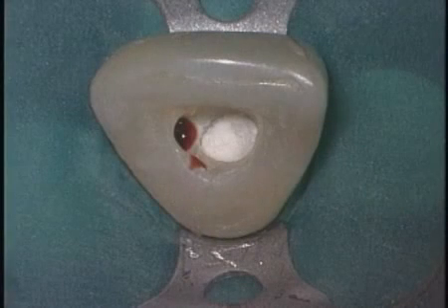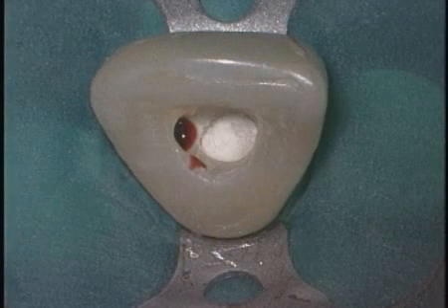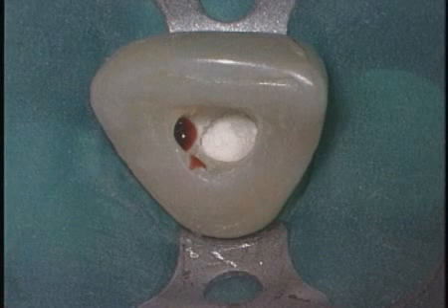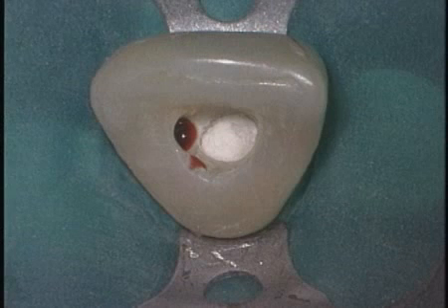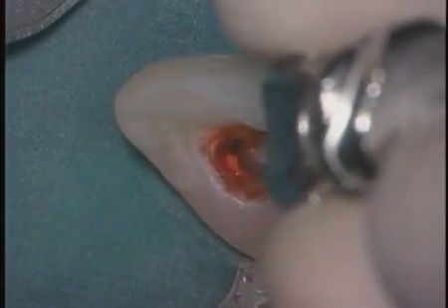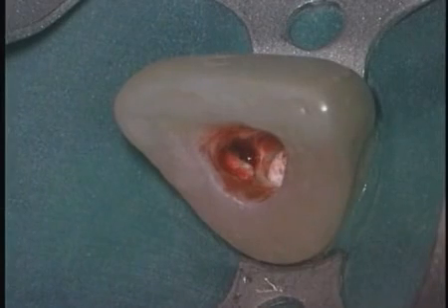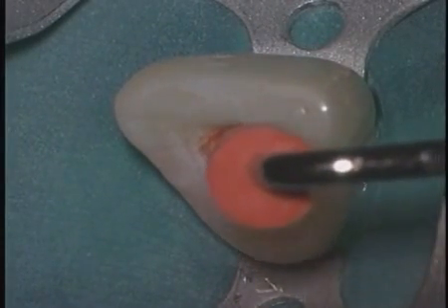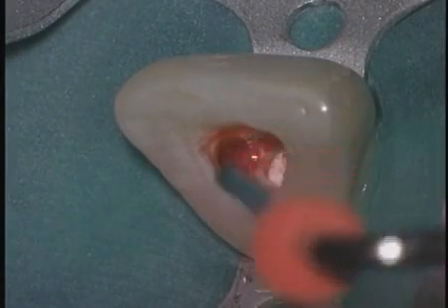Here is a central incisor that has been previously perforated. Note the position of the canal has been protected by using a small piece of Colocoat. Recall, when there are aesthetic considerations, we need to choose the correct barrier restorative. In this instance, we're going to use calcium sulfate, a marvelous material that's absorbed in about 7 to 10 days.